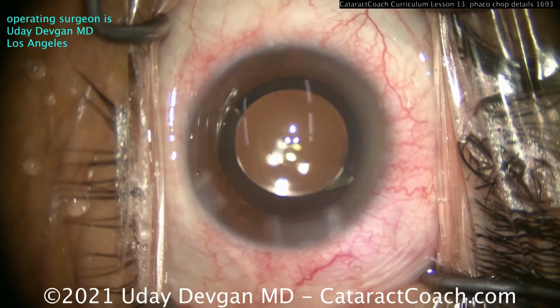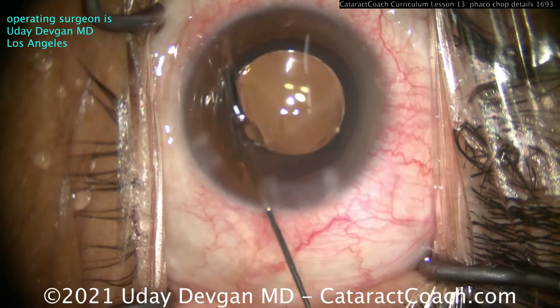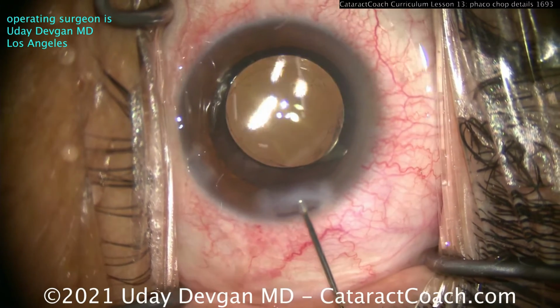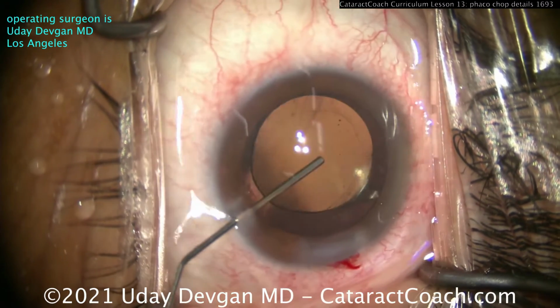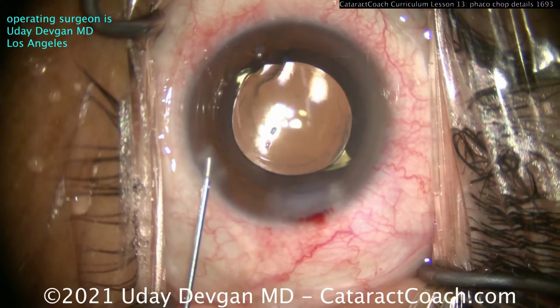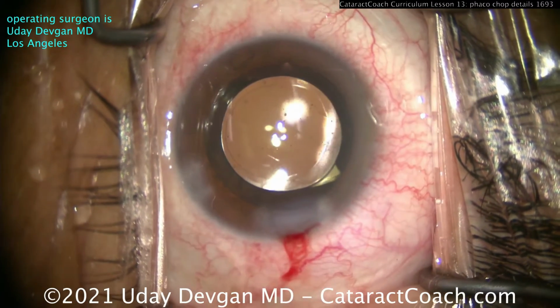Now, if you can't control your foot because you're a newbie surgeon, that's okay. And you say, well, every time I try to go down, I inadvertently hit phaco power. Switch the machine to cortex mode. Then there's no position 3. It's position 1, irrigation, 2, aspiration. You still have the phaco probe hooked up to it. Or go to your energy settings on your phaco and put that to 0, and you won't have that issue. But this is a case that you must know how to handle.